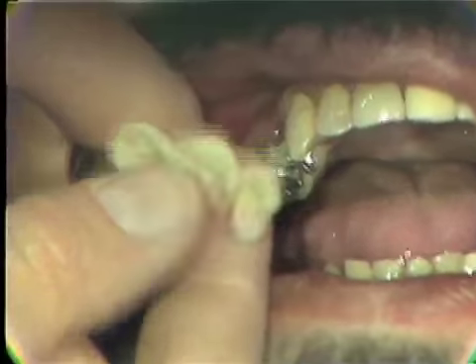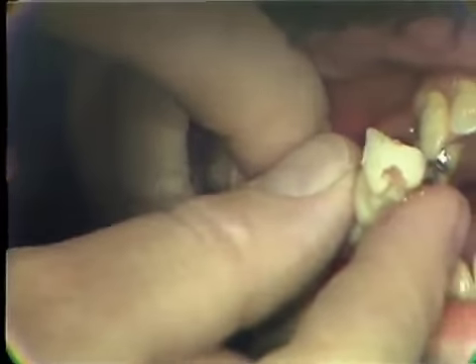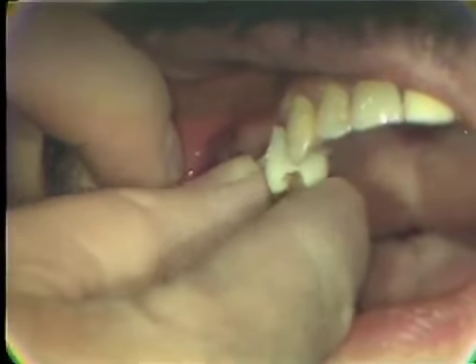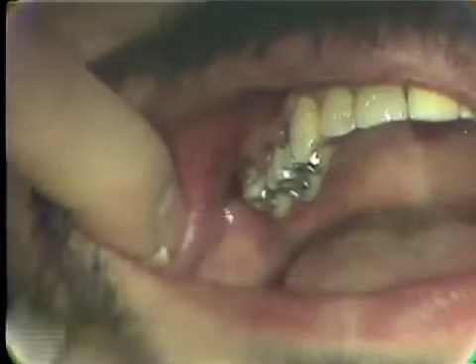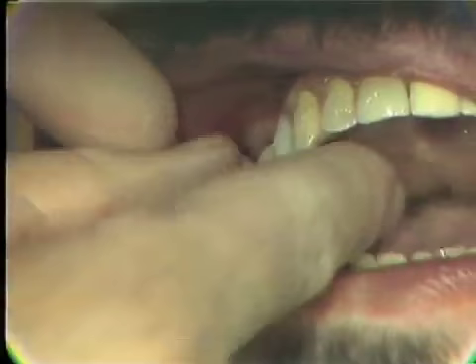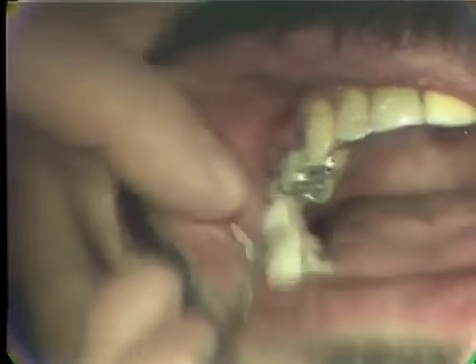And you can see that the new part that we've added is adhered to the temporary. Open, please. As well, put it to place and take it off a couple of times to make sure that it seats properly. Close, please. Open. And then we can go ahead and trim this area and then add to any other areas that we deemed necessary.